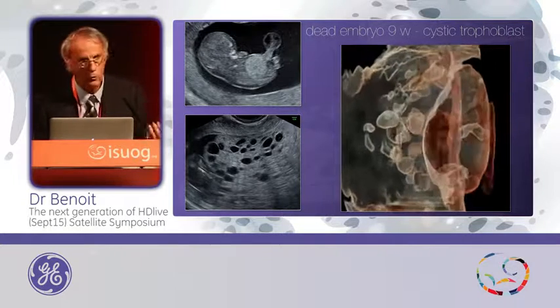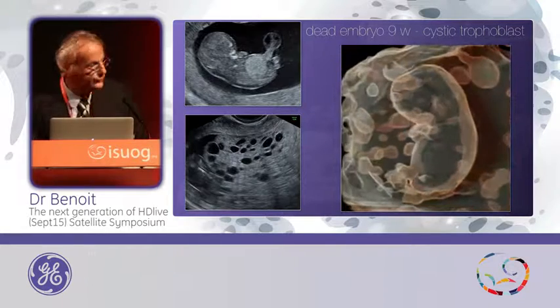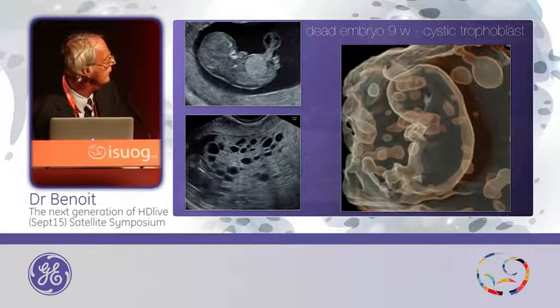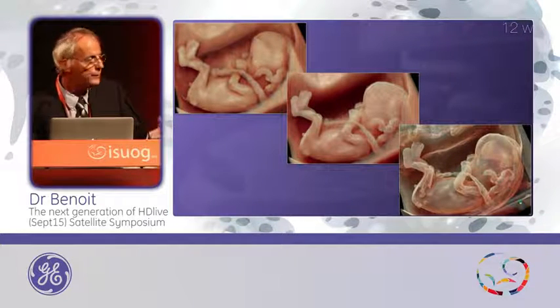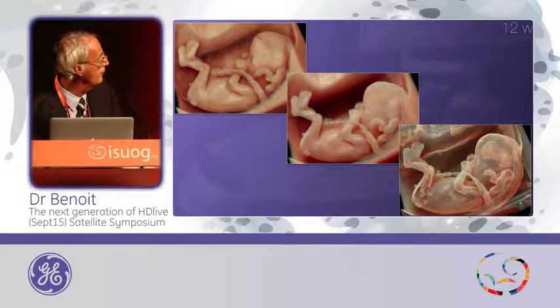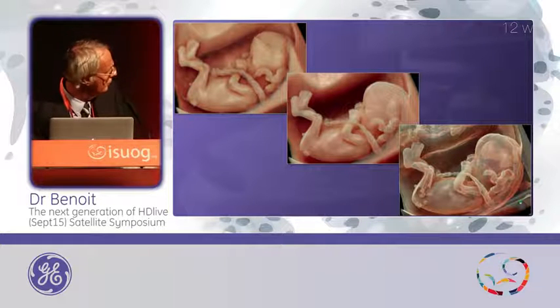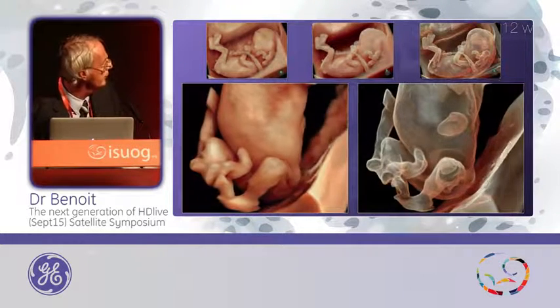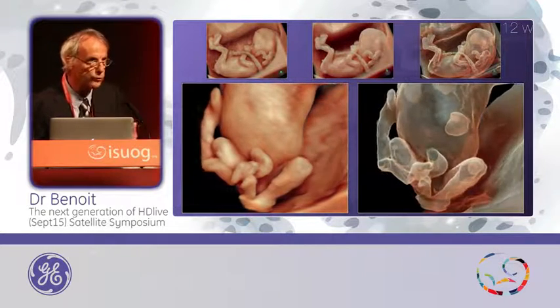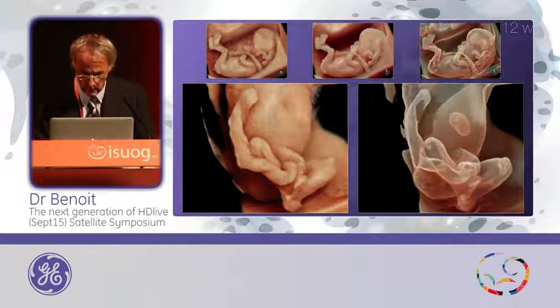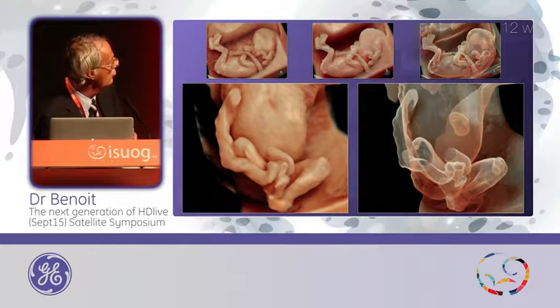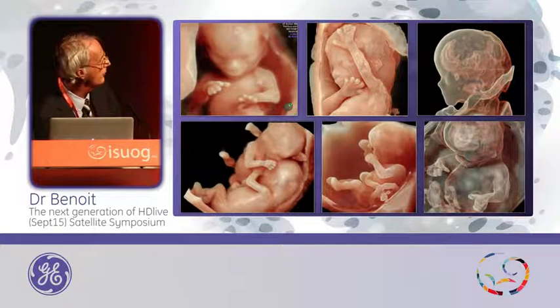Can we use it later, at 12 weeks of pregnancy? Yes. Here you can see HDLive with different levels of silhouette — at maximum and around 50%. With maximum silhouette, you can see inside the brain and also the stomach and the bladder. This is another one at 12 weeks of pregnancy — we just changed the transparency and the silhouette, and inside the abdomen you can see the stomach. Here are some examples of a normal fetus with different levels of silhouette.